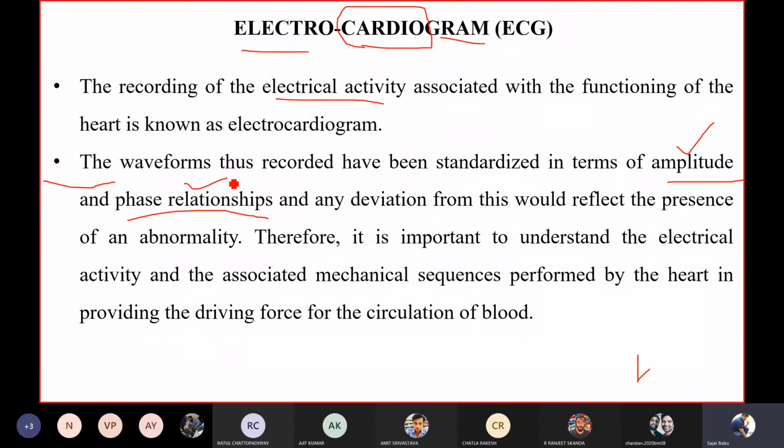For all human beings, it is not like in the EEG, where you get some wave that may be different depending upon the thinking process of the human being, right? I think in the EEG I explained that we can't go through the pattern, where my EEG has one particular pattern and your EEG has another. There we have to go through the frequency levels, like alpha, beta, gamma, delta, and theta. Depending upon these frequency bands in the EEG, we consider whether the person is normal or having some abnormality.